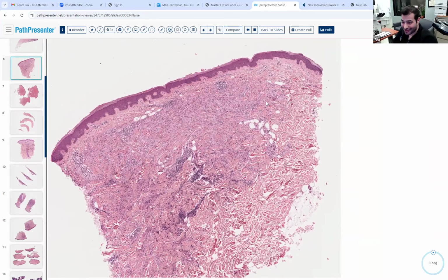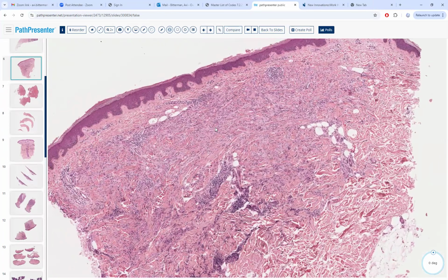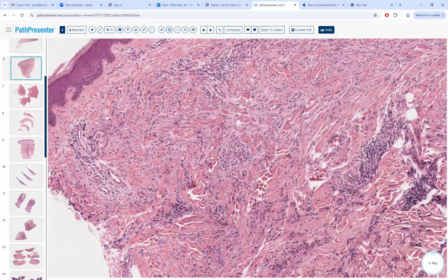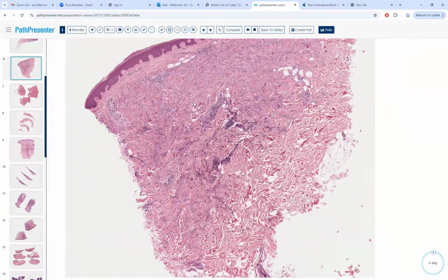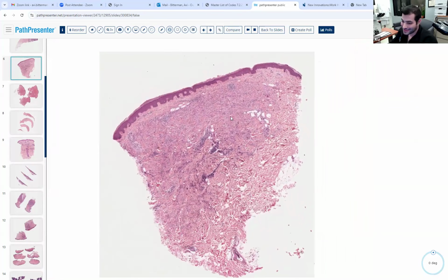Love it. All right, but what are we seeing? Describe it. A histiocytic infiltrate, quite literally infiltrating within the superficial and deeper dermis, and you can see it's all light as well, so that's all mucin in between all these collagen fibrils. Perfect.